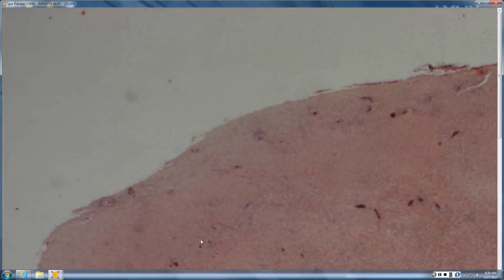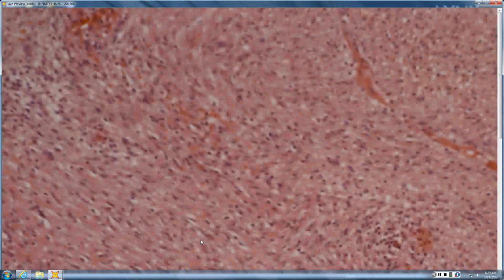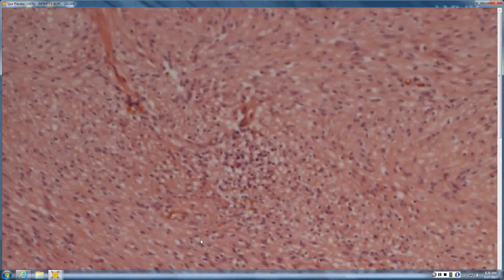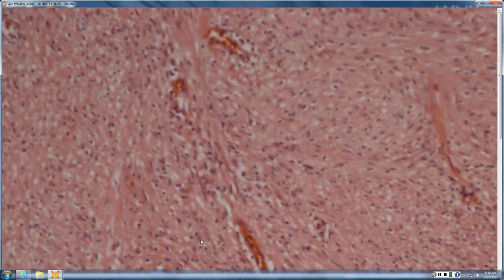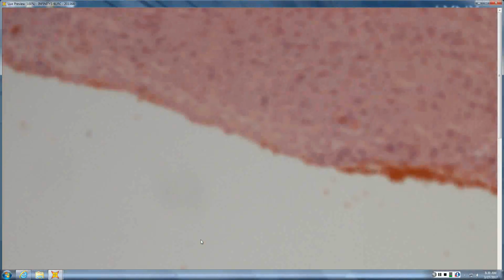So this one is cellular. Yeah, so it's a little cellular, right? I don't see any mitoses. So this one, you might look for mitoses. You might get a Ki67, get a PHH3 looking for mitotic figures, because it looks like neurofibroma. It's getting a little cellular, so you might want some help looking to see if it's proliferative.